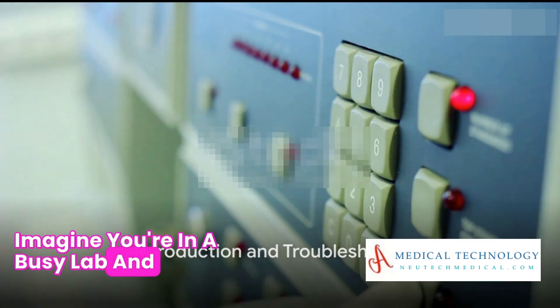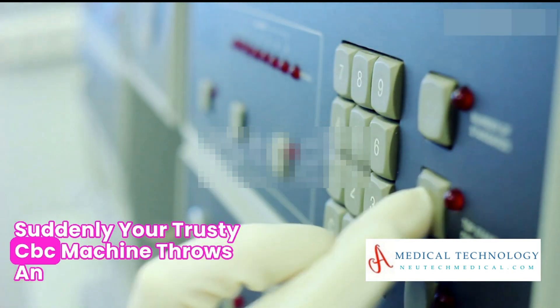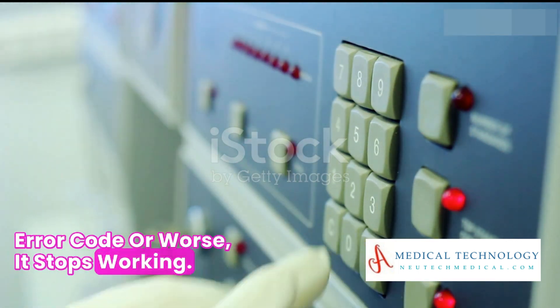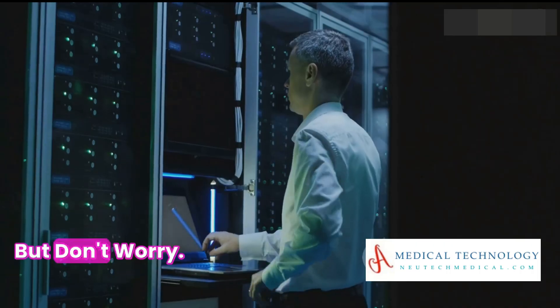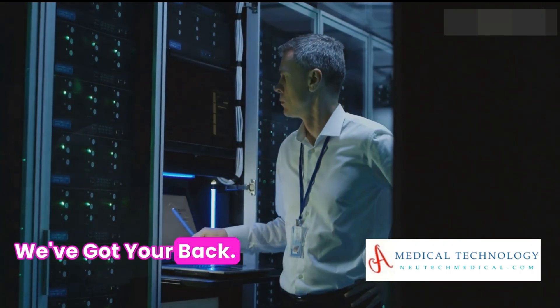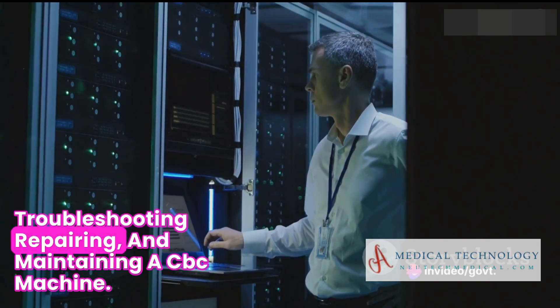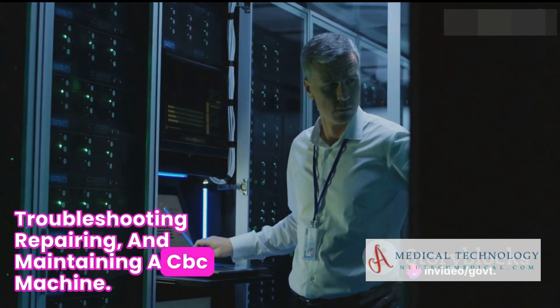Imagine you're in a busy lab and suddenly your trusty CBC machine throws an error code. Or worse, it stops working. Frustrating, isn't it? But don't worry, we've got your back. Today we're diving into the nitty-gritty of troubleshooting, repairing, and maintaining a CBC machine.